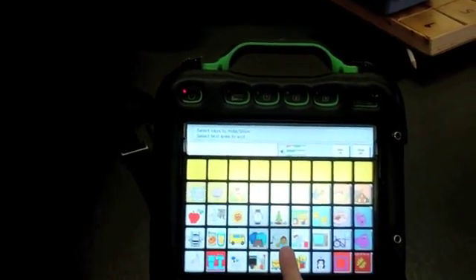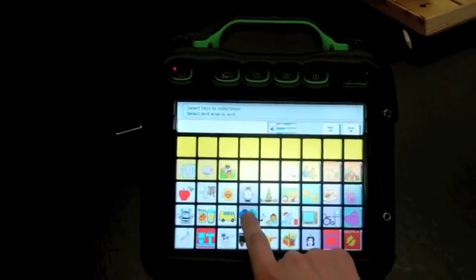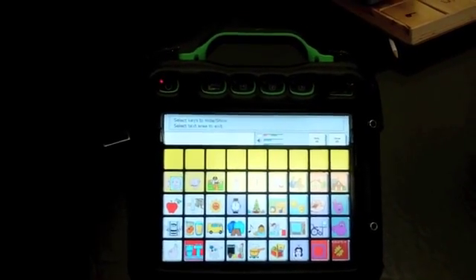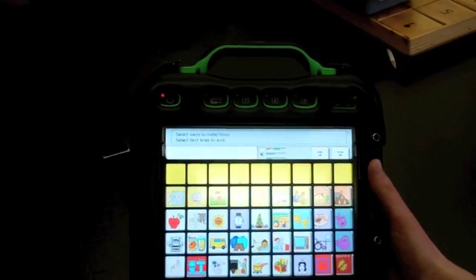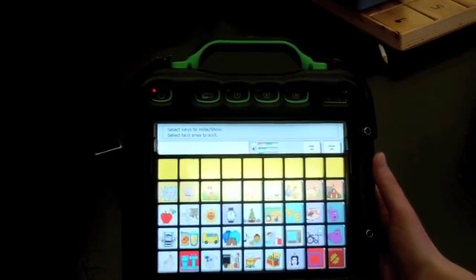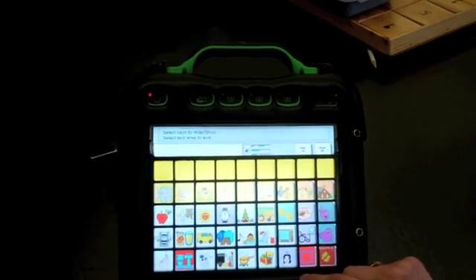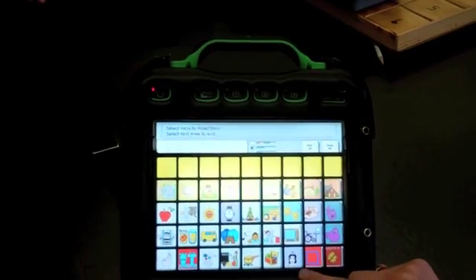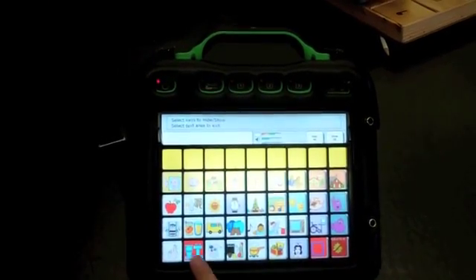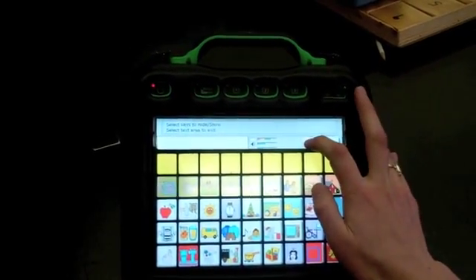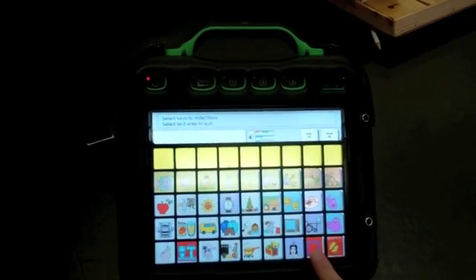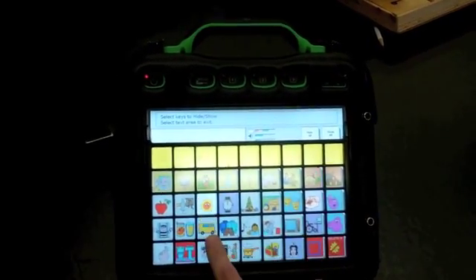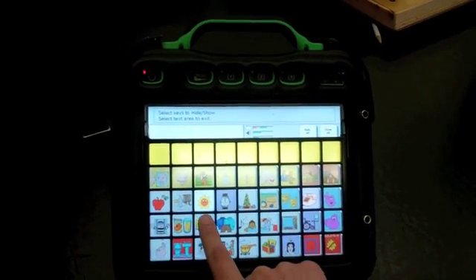Right now I have two that are already hidden. I want to undo those, and for purposes of this demonstration, I want to work on saying good morning with a student, and so I'm going to just only hide the keys that aren't used in the sequence. So I'm going to click hide all to start, then click the sequence that I want him to be able to say.